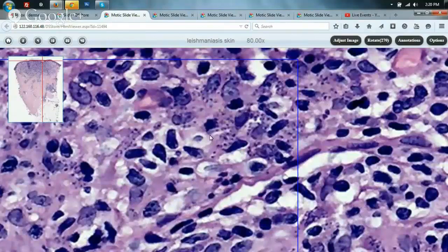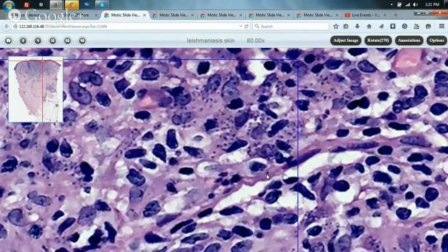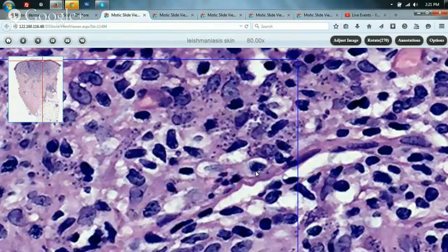On higher magnification we can see them as an eccentric oval nucleus with a rod-shaped kinetoplast separated by an intervening clear space — giving the dot-and-dash appearance typical when performing skin smears. A similar picture is seen in post-kala-azar dermal leishmaniasis; the Leishman-Donovan body is common to both conditions. As the lesions become more chronic and granulomatous, it becomes difficult to demonstrate LD bodies, and diagnosis depends more on clinicopathologic correlation and geographic origin of the patient.